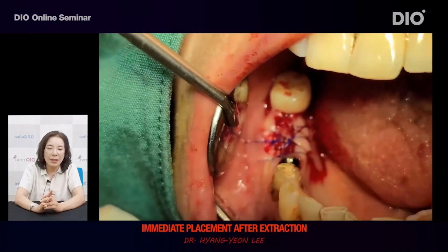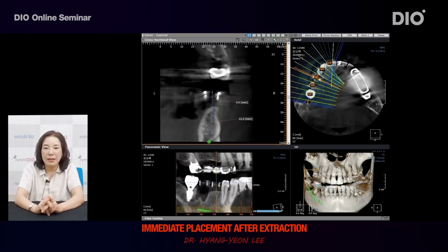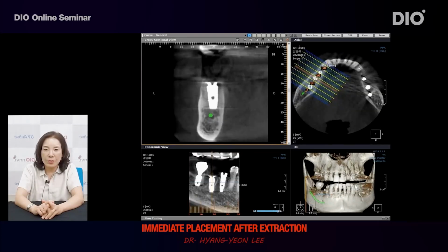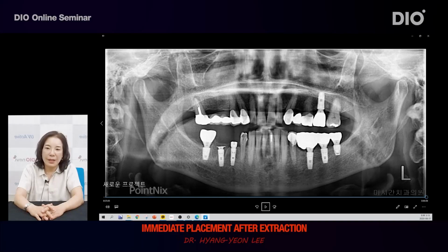The healing abutment is put in the front and the bone-forming screw is put in number 6 with suture performed. It is number 5 prior to the procedure and number 5 after the procedure. It is number 6 prior to the procedure and number 6 after the procedure. This is a photo after the procedure with completed bone implant in the tooth extraction socket side. Thank you.